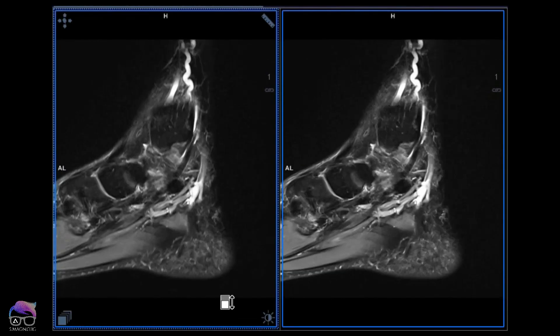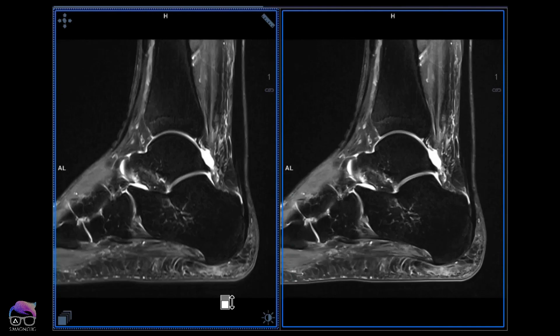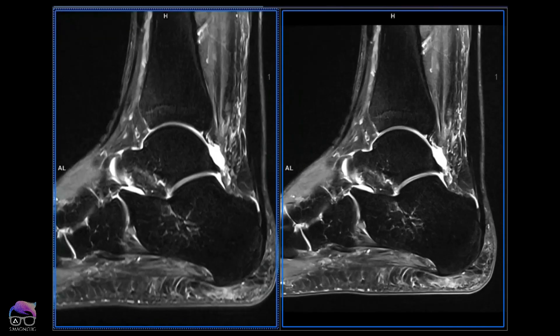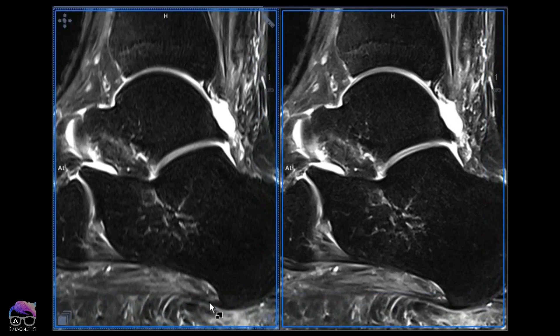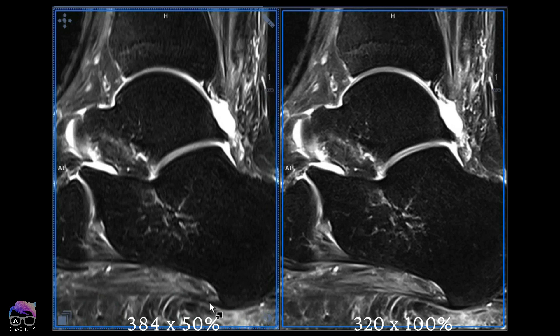Let's move to the fat sat comparison. I'm not going to reveal yet, but as you can see, the first image is not bad on its own — your radiologist might say it's fine for the short scan time. But compared head-to-head with the second image, number two is way sharper. Number one was acquired with rectangular voxel sizes, and number two with square voxel sizes. You can see the big difference — it's much sharper and easy to see.